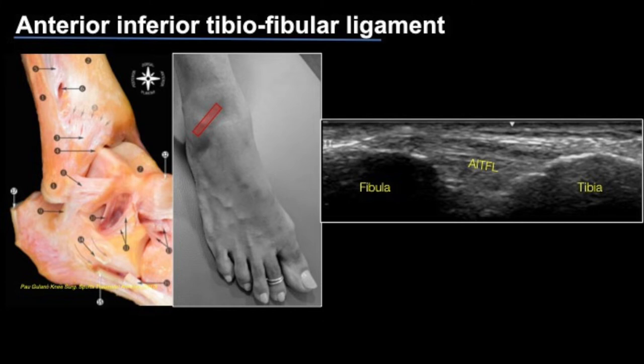The anterior inferior tibiofibular ligament is a syndesmotic ligament spanning the tibia and fibula. It is important to look at the orientation of the fibers of the AITFL so that when we scan it, we identify the fibula and the tibia and place the probe obliquely in the direction of the fibers. This allows us to see the AITFL as an echogenic structure with multiple linear striations.